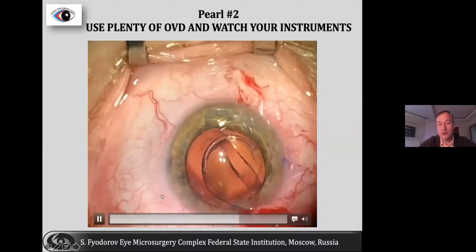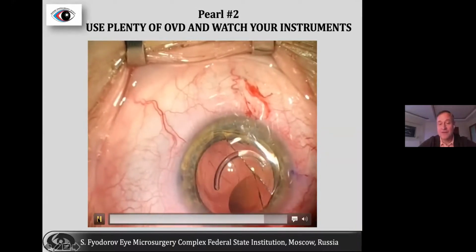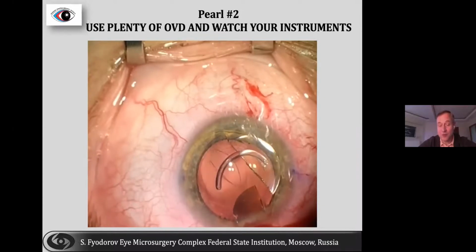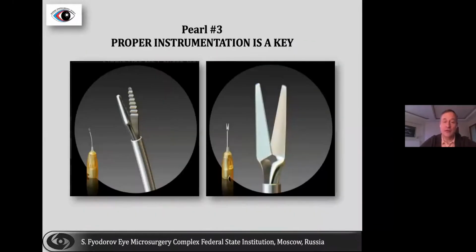So it was quite an unfavorable situation here, because I needed to reimplant the other toric IOL with the open capsule. That might be challenging. However, this case was completed quite successfully at the end, but I will not be showing the whole case. So be sure that the tips of your instruments are rounded rather than sharp, and be sure that you have another instrument that you can introduce into the anterior chamber and stabilize the lens, which is also very important.